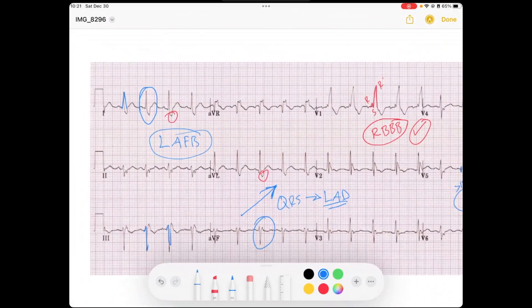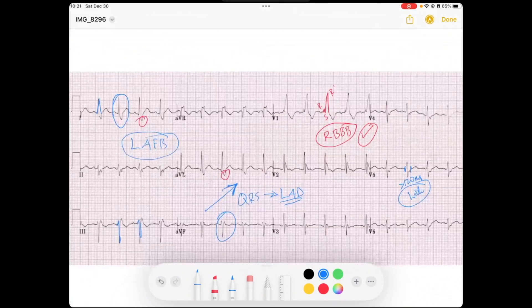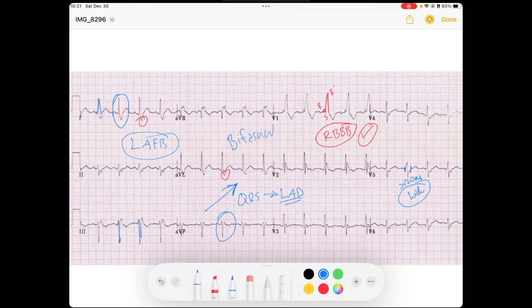So this is a good example of a right bundle branch block with a left anterior fascicular block — one type of bifascicular block. When you call this a bifascicular block, make sure you also annotate which two of the three fascicles are blocked.